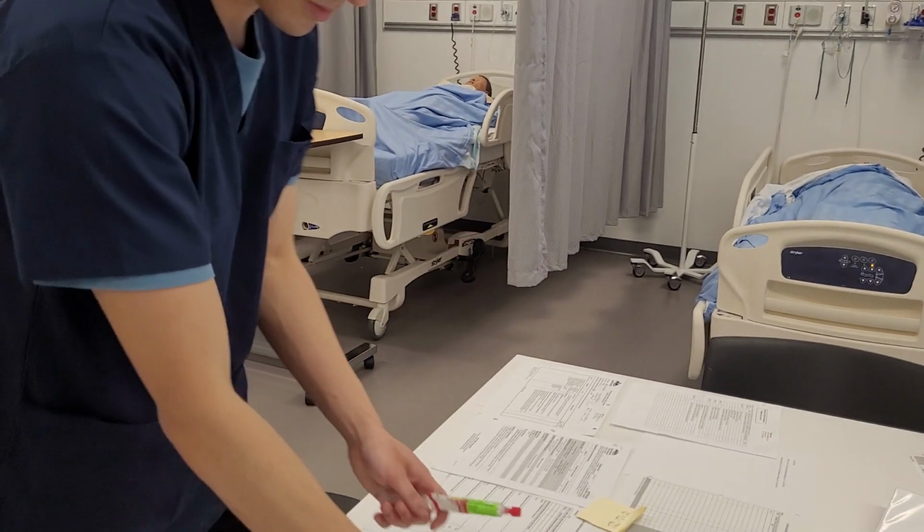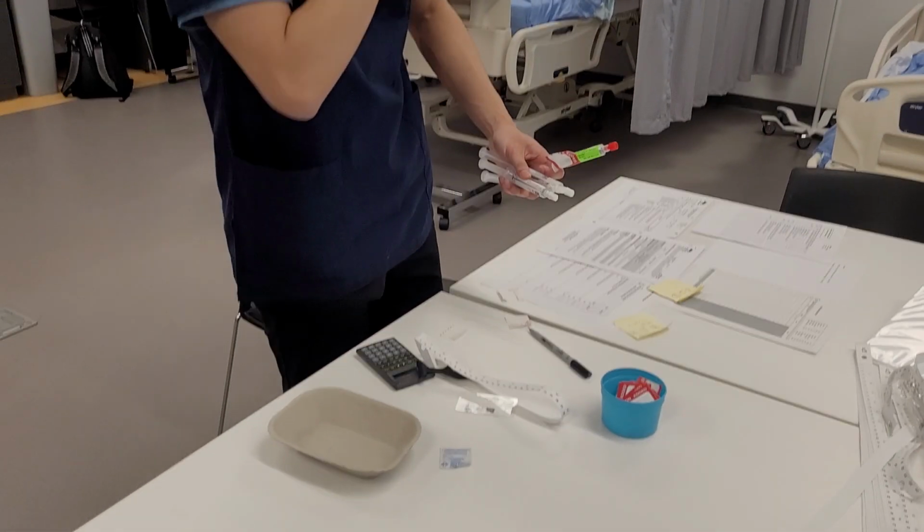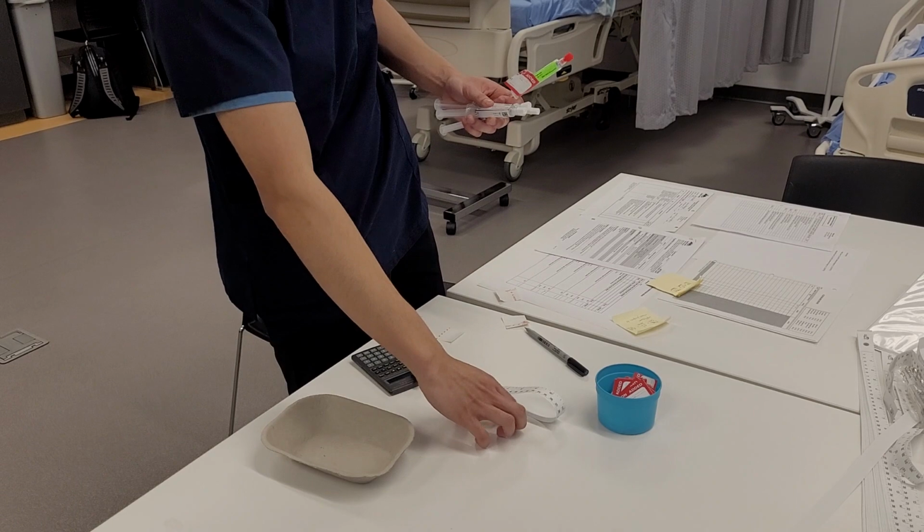Alright. So now we're ready to enter the patient's room. I'm just going to gather all my equipment over here.